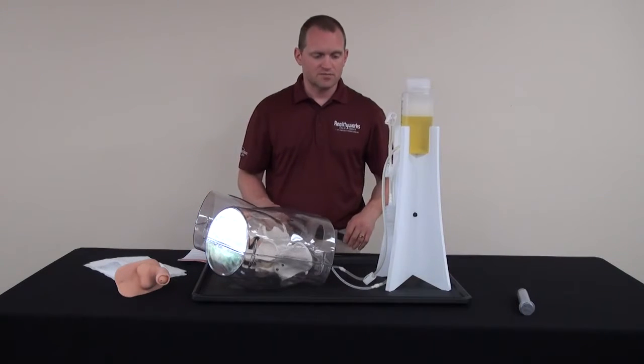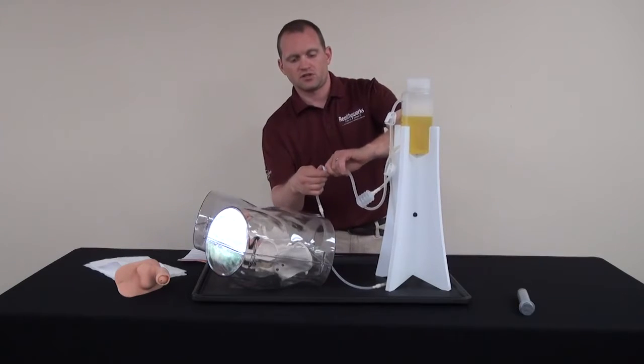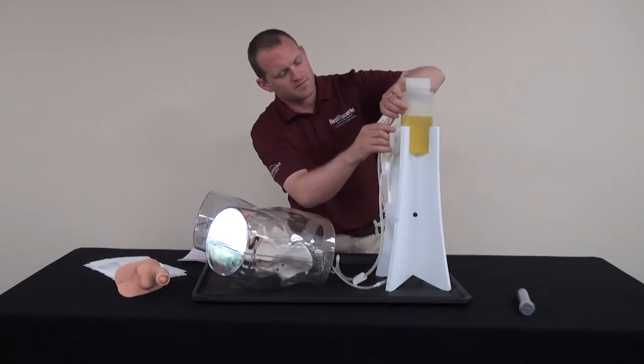I'm going to show you how to disconnect and clean the bladder and genitalia assembly. So, begin by closing the clamps.